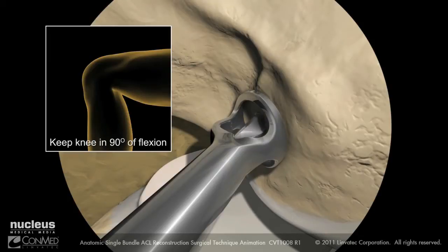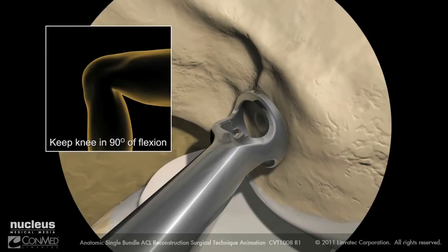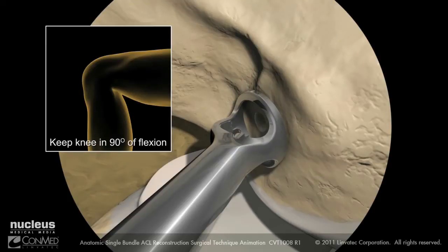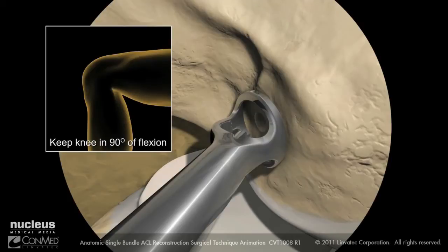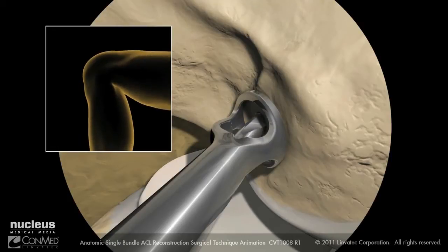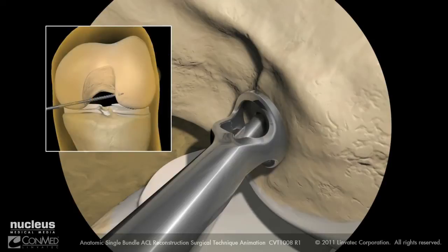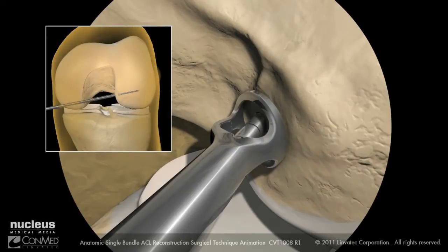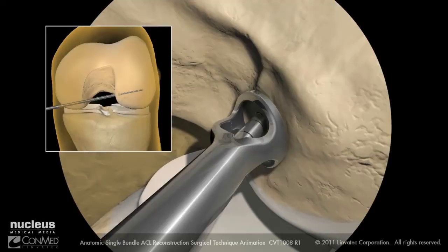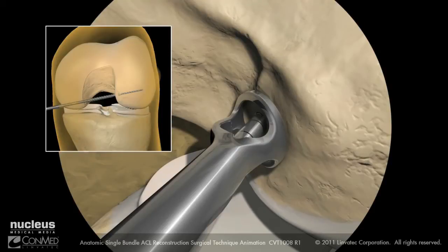Back the guide pin out to check that it correlates to the mark made earlier at the center of the footprint. Using the guide to position the guide pin, hyperflex and elevate the knee. Advance the guide pin to the lateral femoral cortex, noting the aperture to cortex depth, then advance it out of the skin.